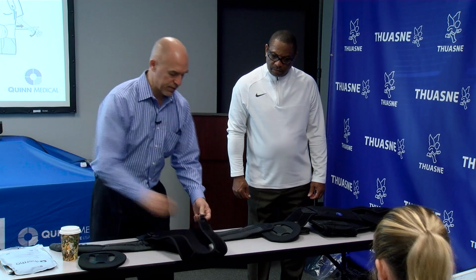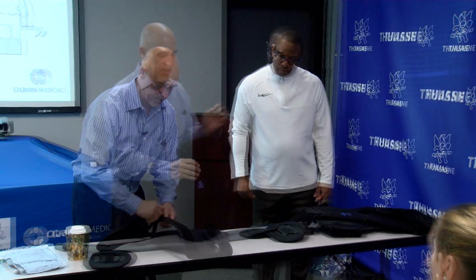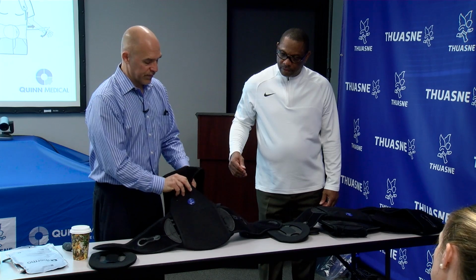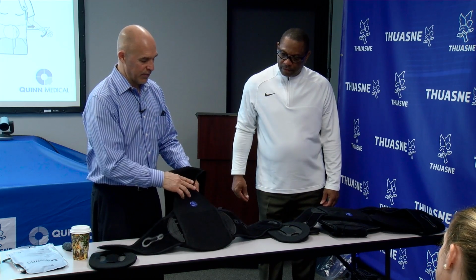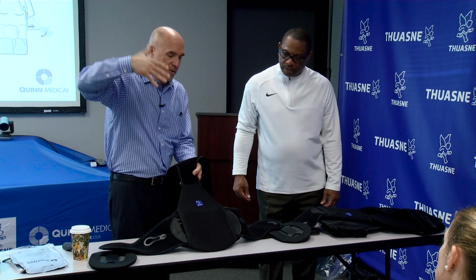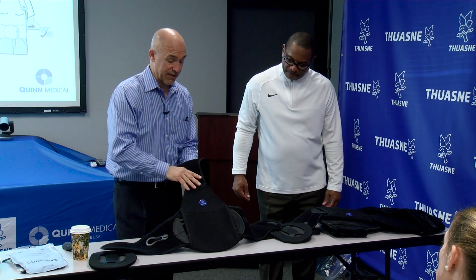What I would first do is loosen the shoulder straps. So just pull these out. This part of the brace telescopes up and down. So for anybody over 6 foot, I would move this up a little bit because you don't want it to get hung up and be too high on the patient. But out of the package, 6 foot and under, I would just leave it.